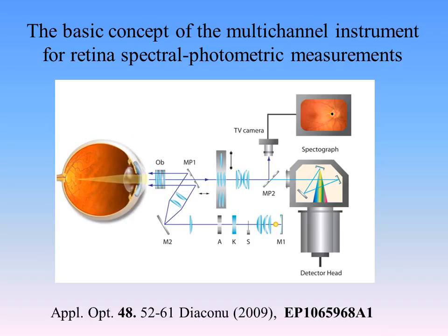The image of the fundus is projected here at this mirror. Here we have a pinhole with an optical fiber that catches the light and brings it to the spectrograph, and each point is represented by 200 measurements from 400 to 600 nanometers. It's a lot of wavelengths. The black point here on the image represents exactly the point where the measurement is made.